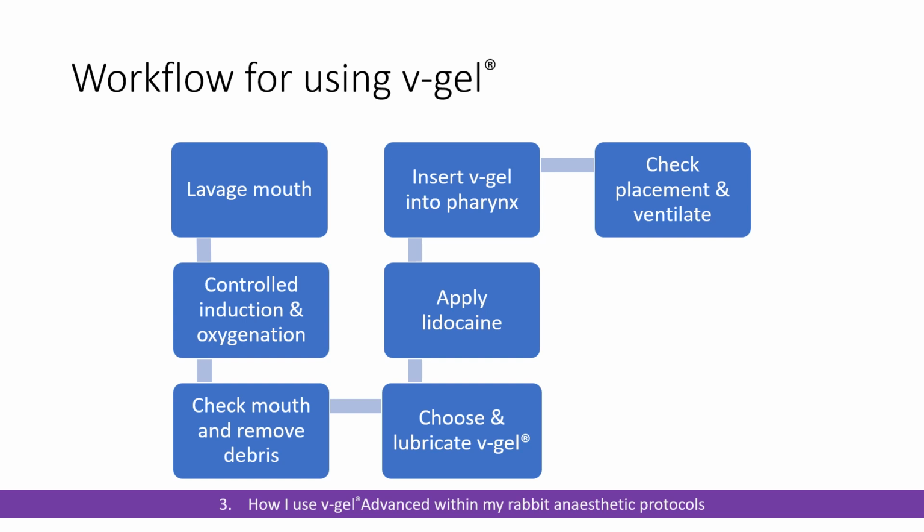Once I've got that sorted, then I will normally drop that back to breaths around every 7 to 10 seconds, and then I'll look at my capnograph to adjust the ventilation speed and depth. If you're ventilating with a rebreathing bag, you will still need to ventilate for rabbit anaesthetics because they don't breathe that well, and you just alter the amount of squeeze and the frequency of squeeze to keep your CO2 readings within acceptable limits.